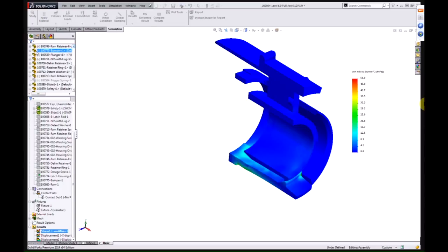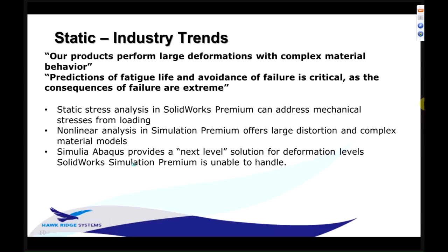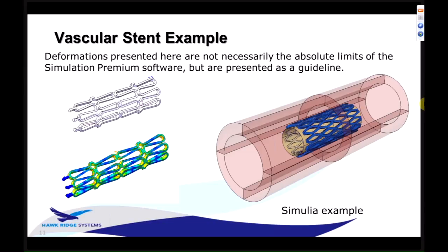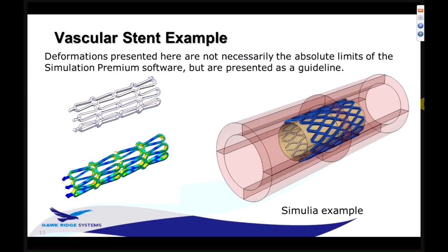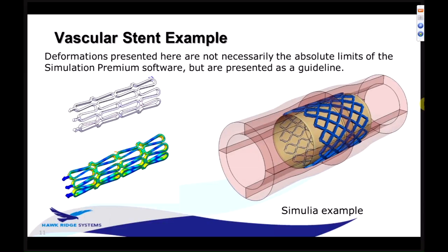So if we move on to the next thing, the classic kind of case that people think of when they talk about nonlinear analysis in the medical device industry is some sort of stent, right? A device that's implanted inside either an artery or some other vessel of a patient, and it's basically doing the job of holding that vessel open so it doesn't collapse, as the collapse is causing medical conditions. It's a pretty complex situation. The parts are made from typically some variation of nitinol, which is a shape memory alloy.